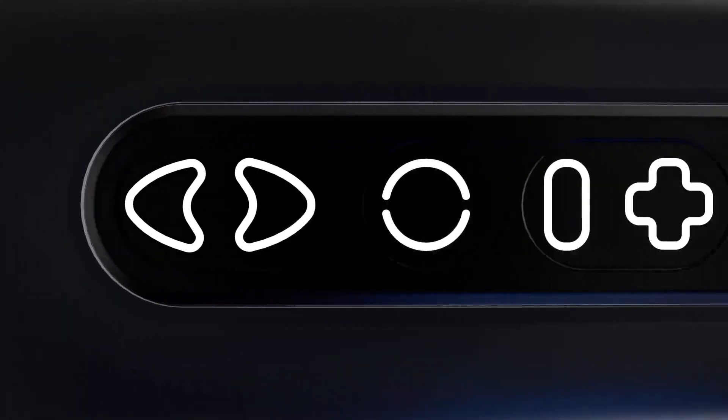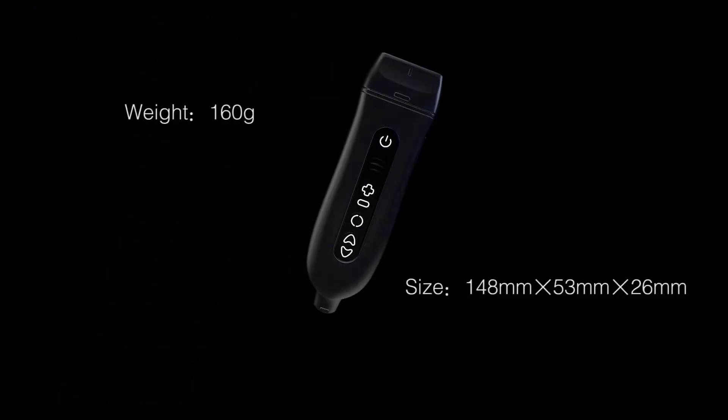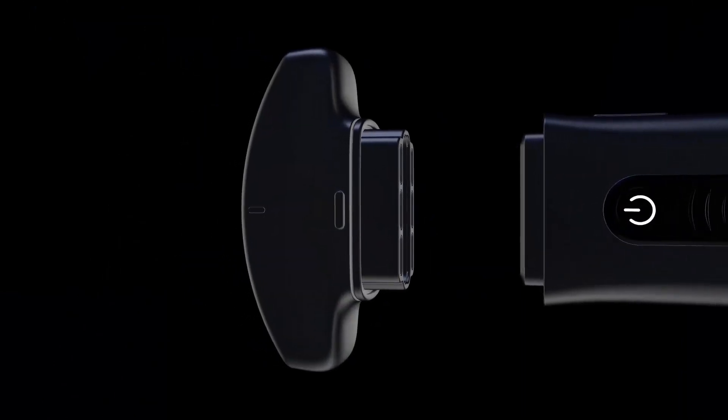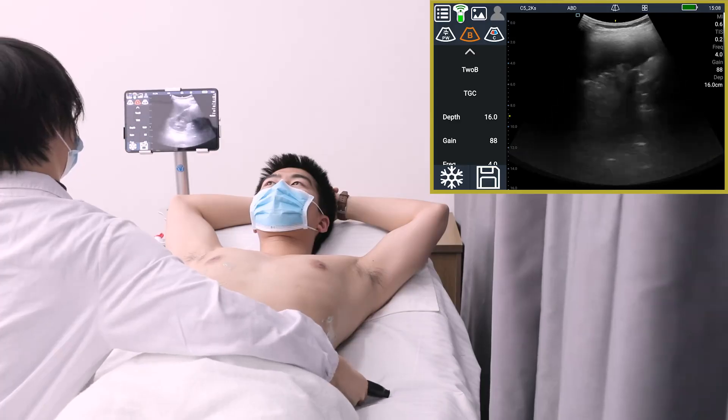Have you ever thought that ultrasound can be as small as your hand? We pursue the ultimate small and light medical imaging device — a real handheld wireless mobile ultrasound system. Patented probe head switching technology means one handheld machine can meet the requirements of whole body examination, with the lowest power consumption for the longest scanning time.